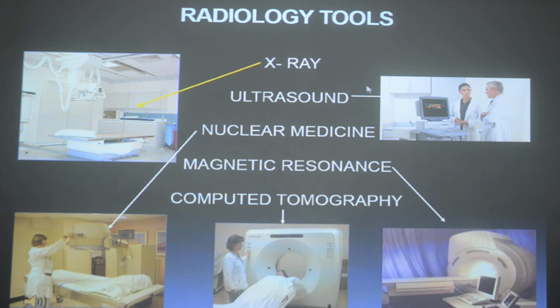Yes, there is a role in X-rays, but obviously you will still need to know details of the brain, what is underlying. If you have a skull fracture, so what? Still you would like to see whether the skull fracture has resulted in trauma to the brain underlying. So you would still do a CT scan. So X-rays are now hardly done for skulls. To see what is going on in the brain, you need to do an MR or a CT.